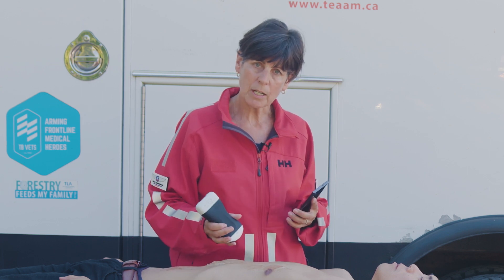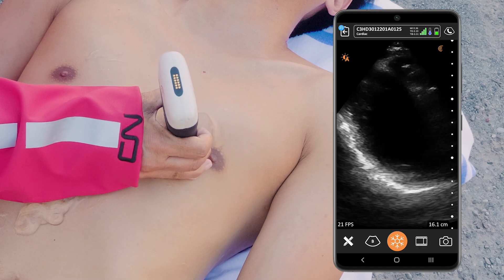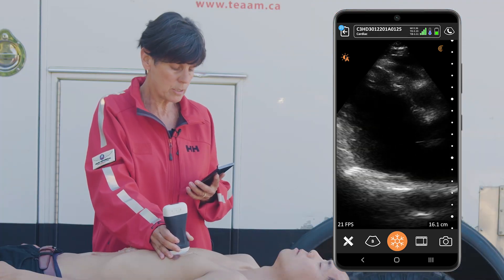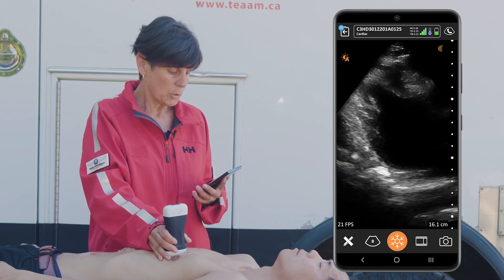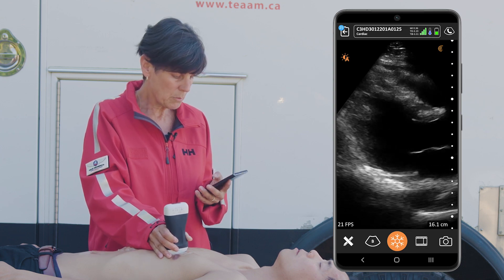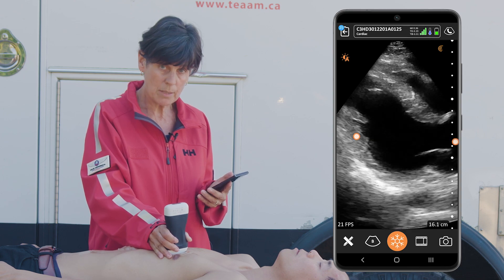We're going to look at a couple of different areas on the body and I'm going to start with the heart. I've selected the auto preset, I'm using the C3 scanner, and it's going to take us directly to the cardiac preset using the AI. What I'm looking for here is to make sure that the heart is contracting normally, and in this situation we're seeing nice contractility of the left ventricle and nice movement of the mitral valve.